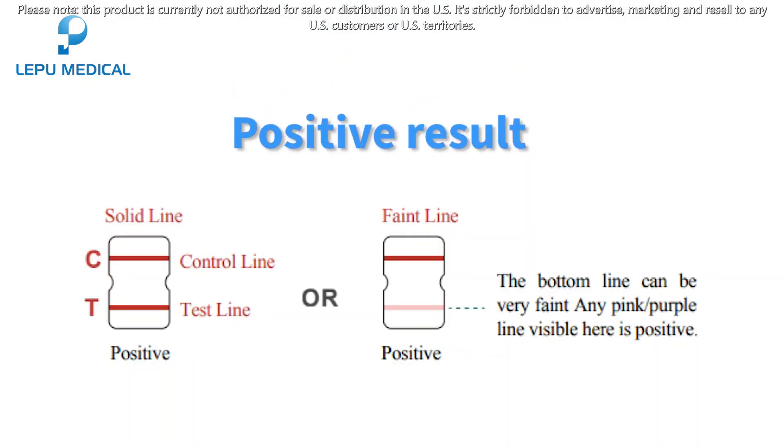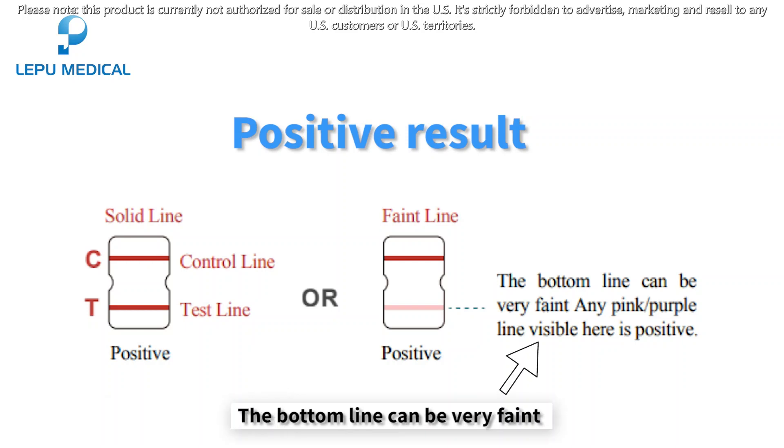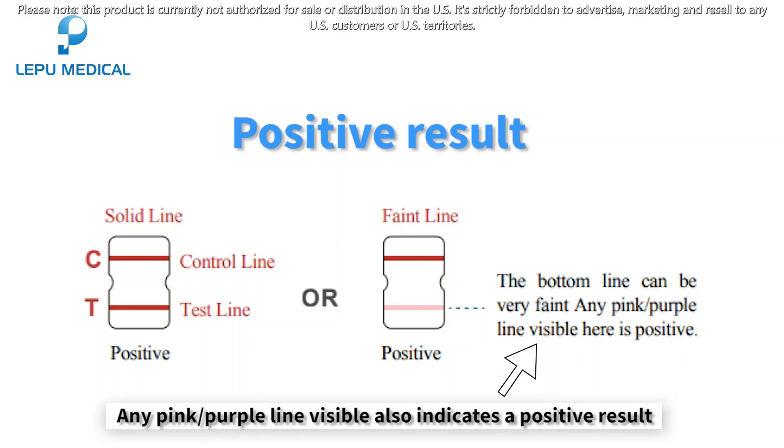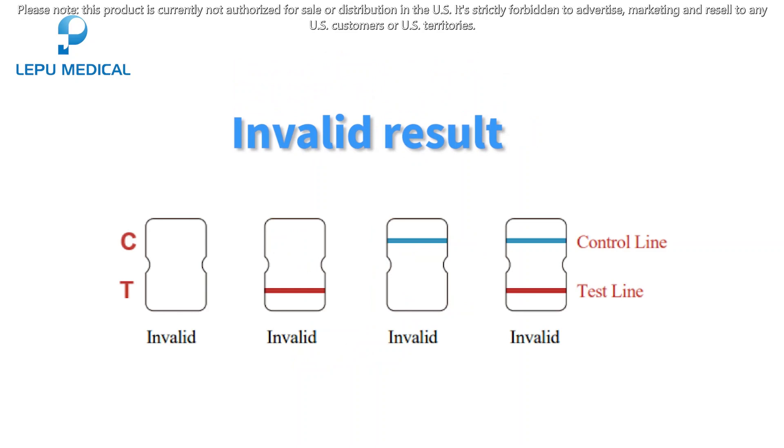Positive result: a purple-red band appears in both the control line and the test line. The bottom line can be very faint — any pink or purple line visible also indicates a positive result. Negative result: only the control line shows a purple-red band, and no purple-red band appears in the test line.